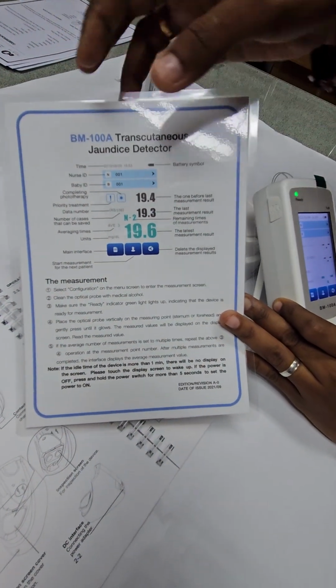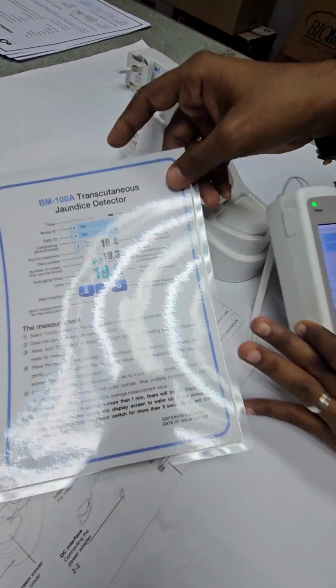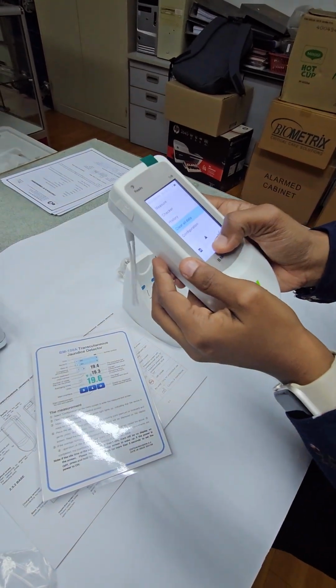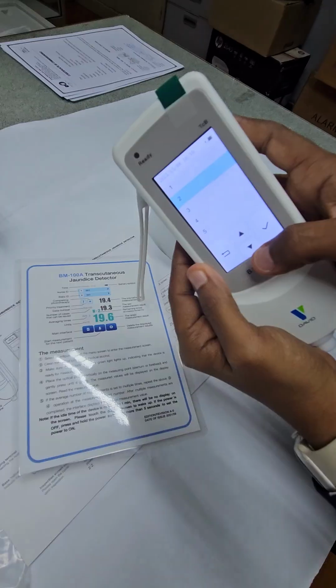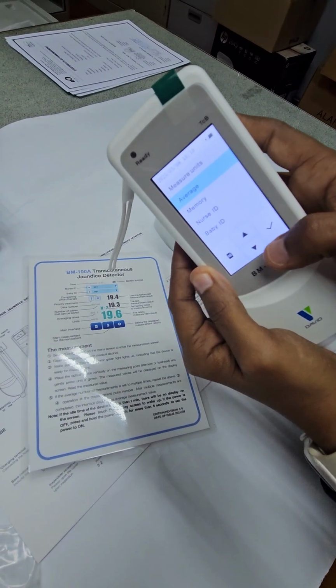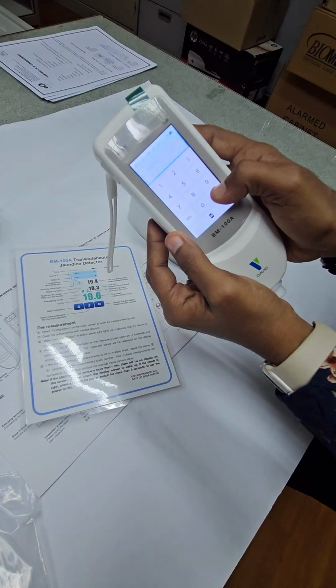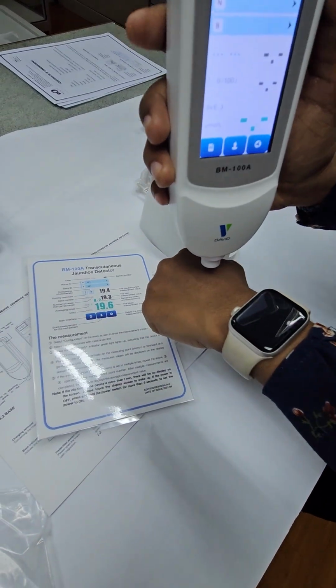You do 3 times, you get the average? Yes, we get the average. Maybe I can show you here. I set the average to 3 times. I'm showing an example.